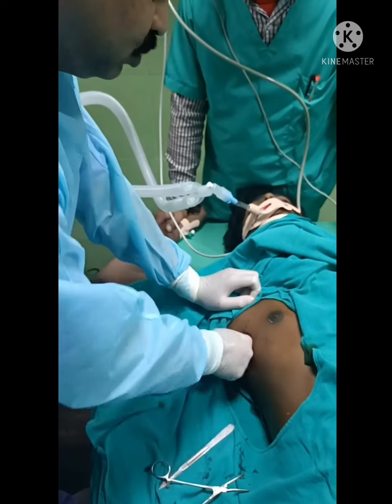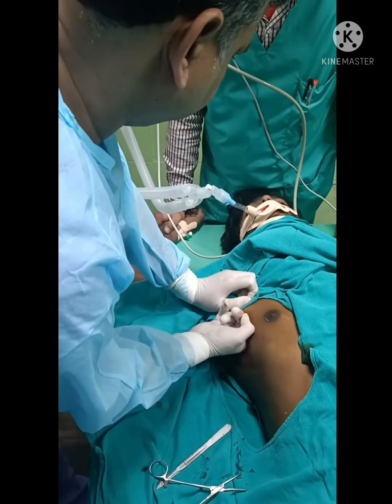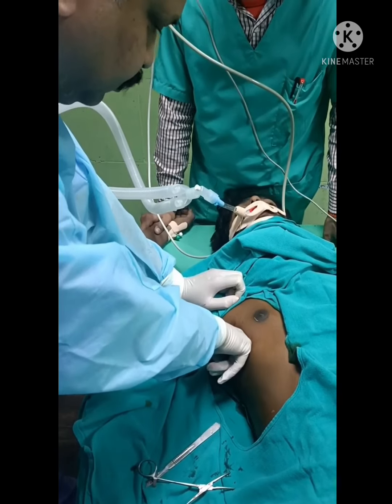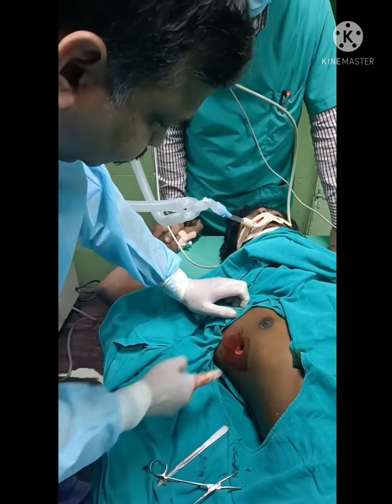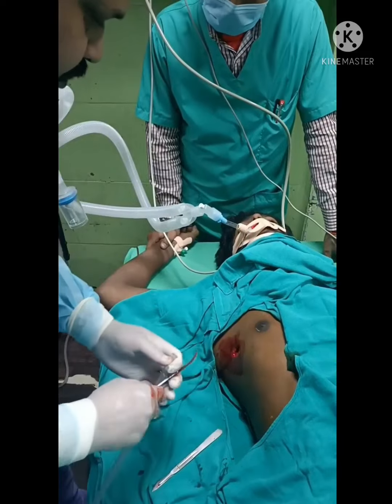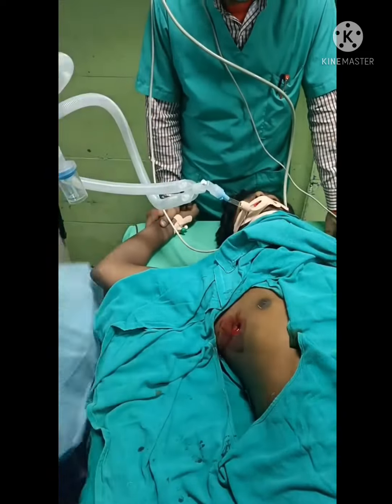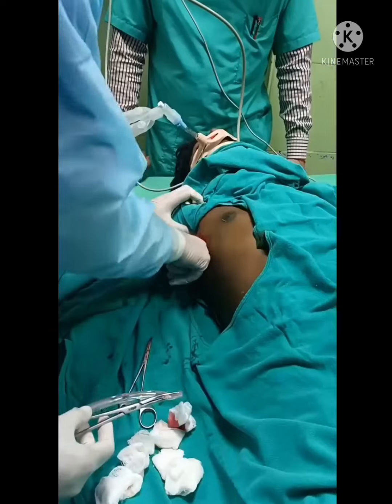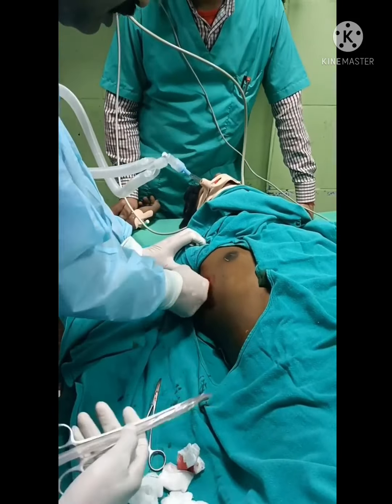So then you do the finger sweep and feel the lungs. So you can see the blood coming out. Let's just sit down. That is good. So insert the finger, and feel the inflation and deflation of the lung.